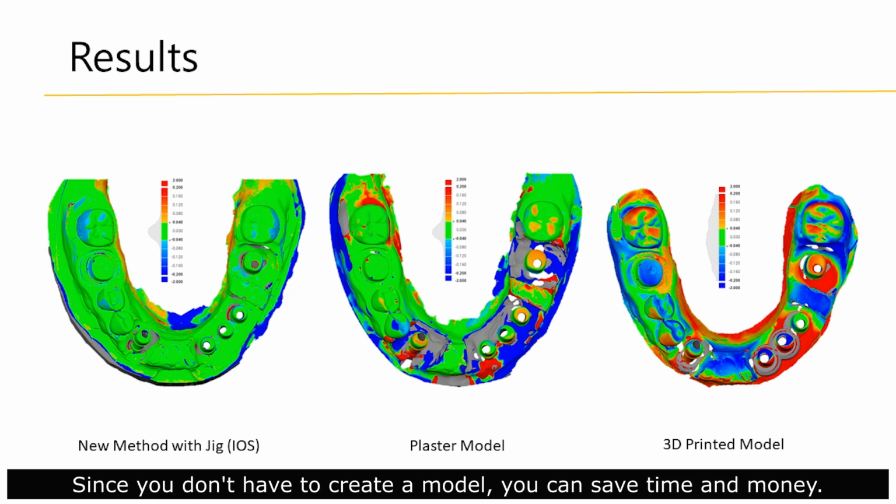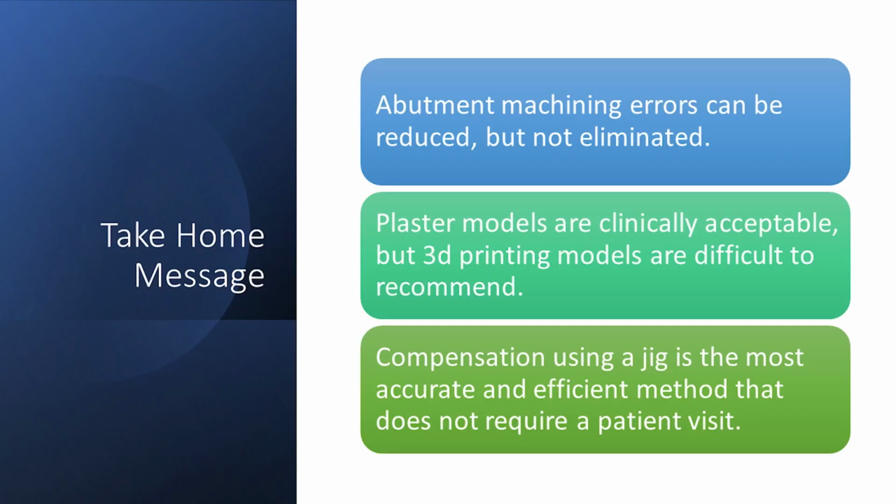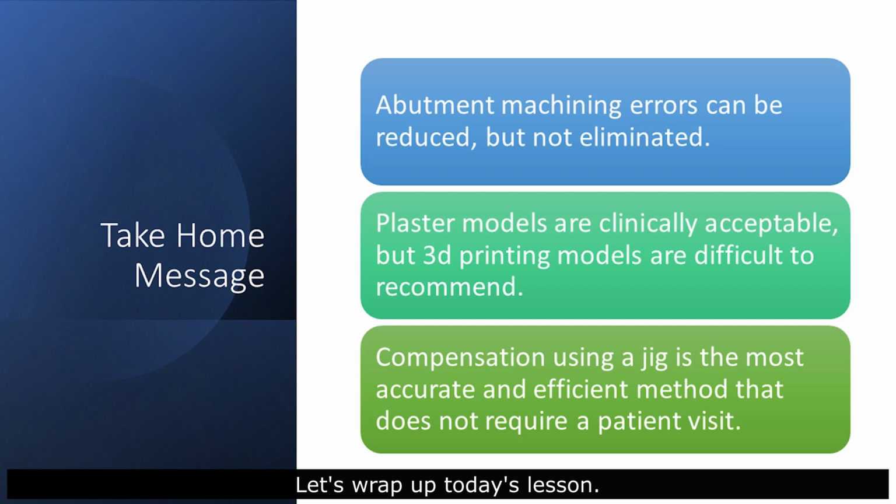Since you don't have to create a model, you can save time and money. Furthermore, by automating this process, it is expected that the AI abutment matching shown earlier will be implemented without the patient visiting the clinic. Let's wrap up today's lesson.